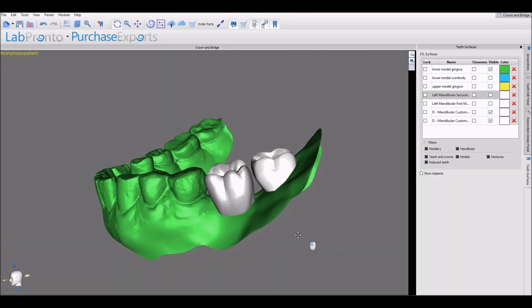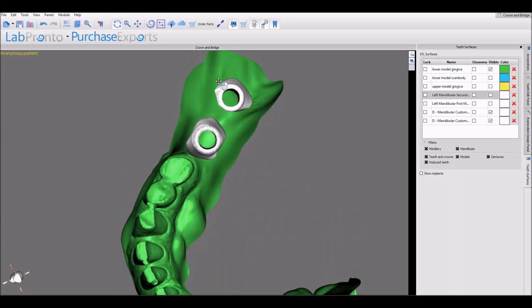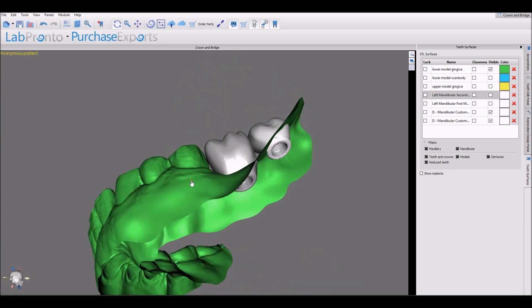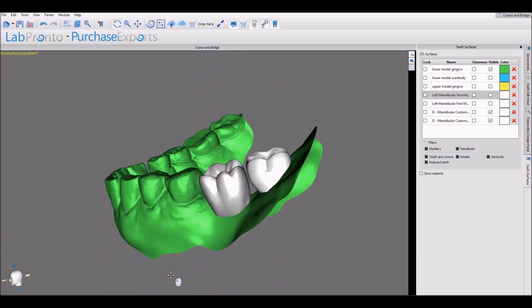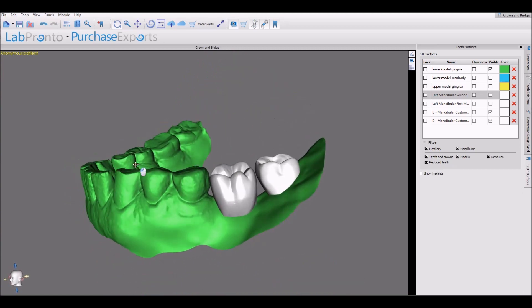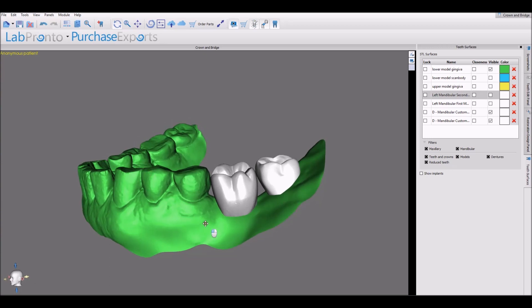In a previous video we showed how we designed crowns for titanium basins. Now let's take a look at what the process would be if we want to convert these into a bridge.